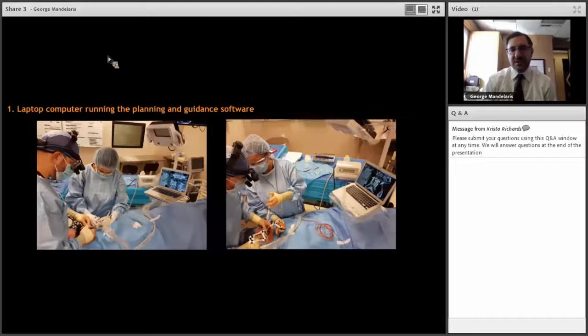And this was the first generation head tracker that was used. It looked like a little Y, but it's basically paired to a pair of glasses. You can see the drill tag here on my handpiece and the jaw tag that is affixed to the lower arch with composite. It does take a little getting used to. It takes at least 30 cases or so to really become proficient.